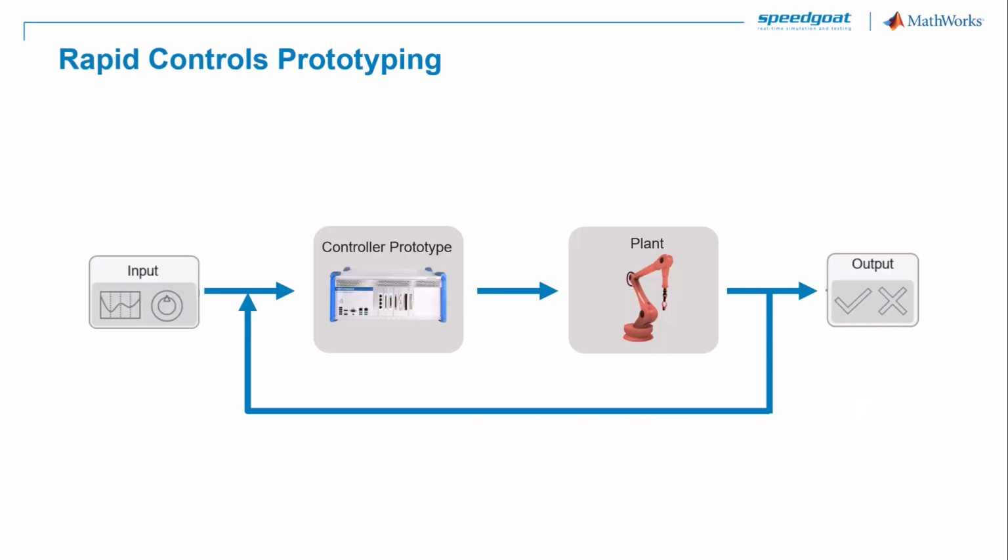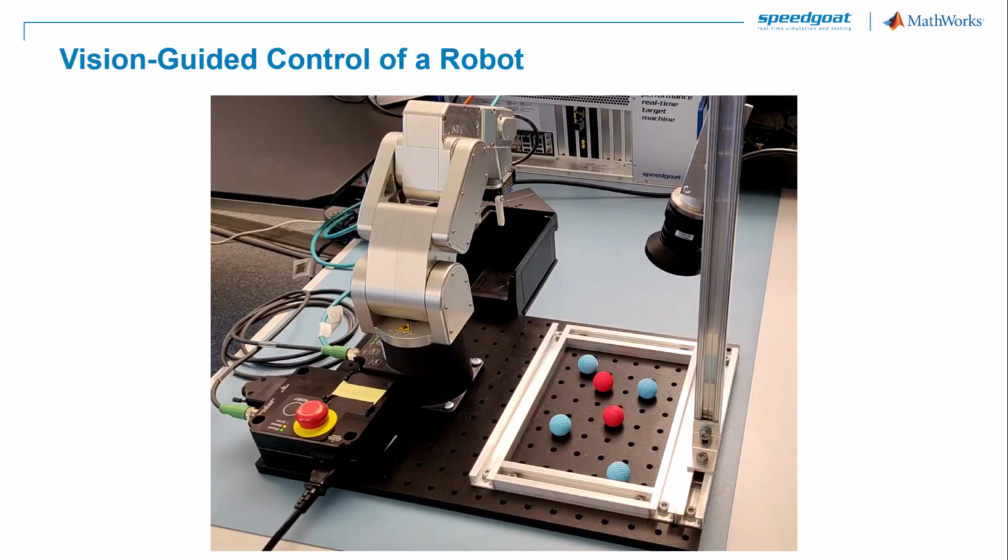We will work with a prototype controller deployed to a Speedgoat machine, and the plant will be an actual robotic arm with a gripper. The input will be the very same vision signals from the camera that we saw on the previous slide. This is my hardware for testing. As placeholders for the physiological marker, I'm simply using different colored balls, where the red ones represent the physiological markers that need to be removed. The camera is mounted at a fixed angle overhead on the opposite side of the robot.